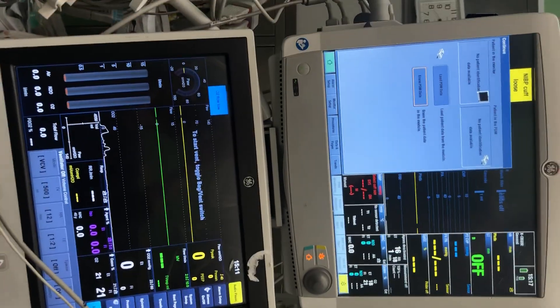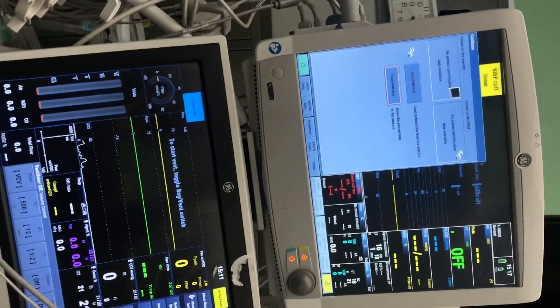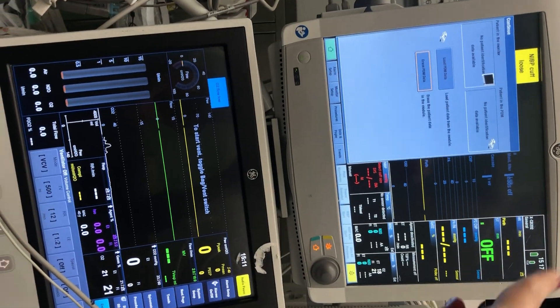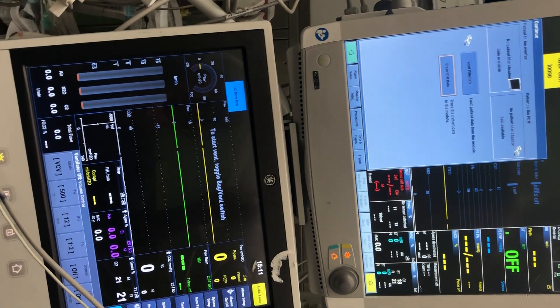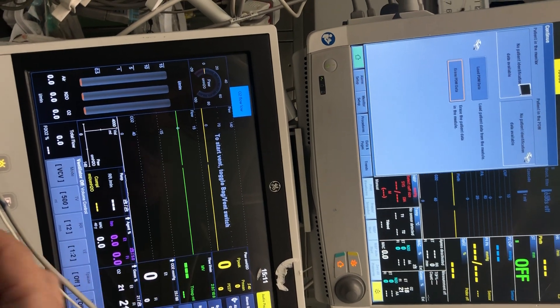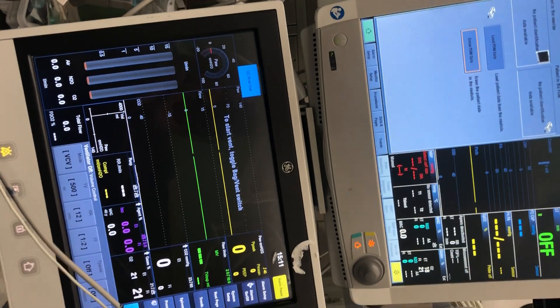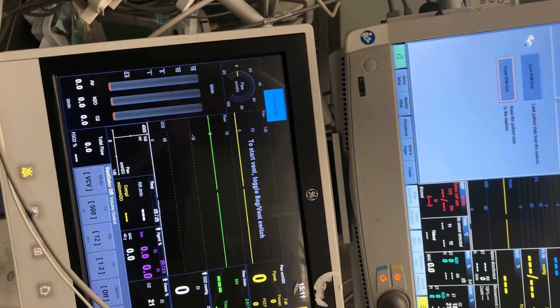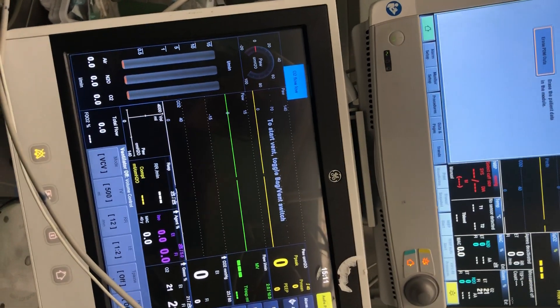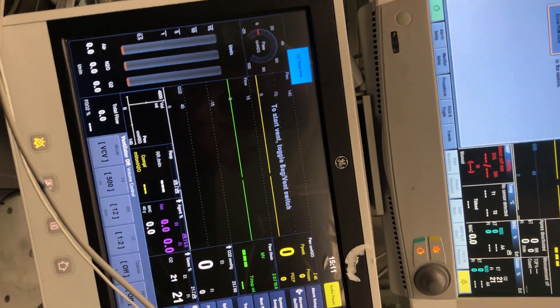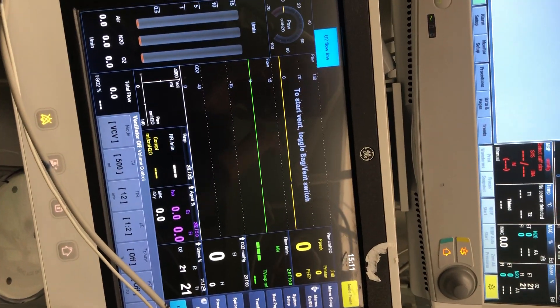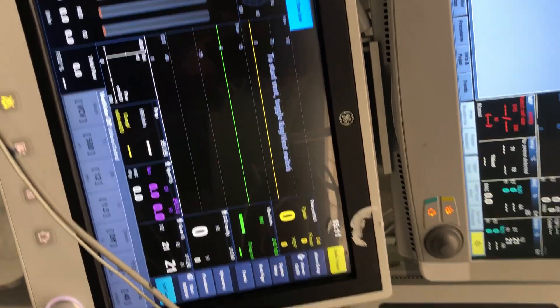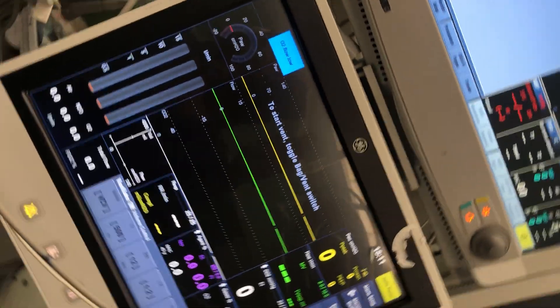Anesthetic machines usually have at least two screens. The top screen shows all the monitoring information about the patient. The bottom screen gives information about ventilation — airway pressures and so forth — and also allows you to set your ventilation parameters.